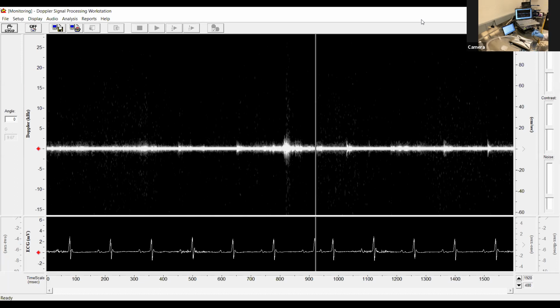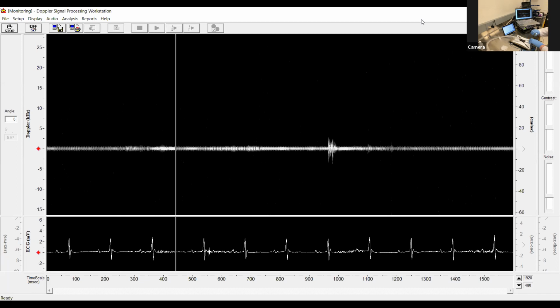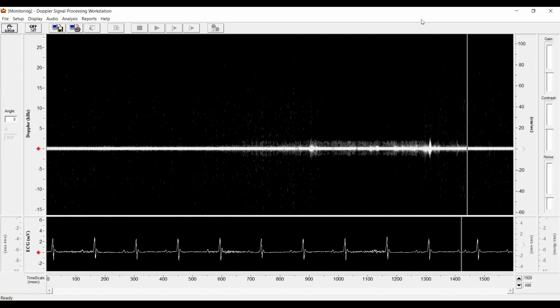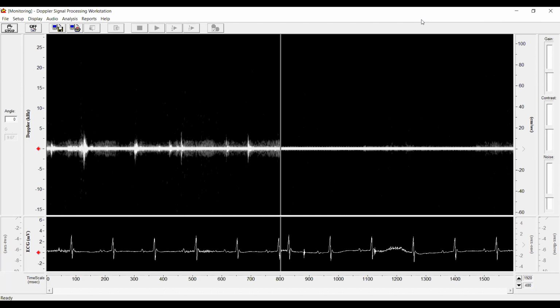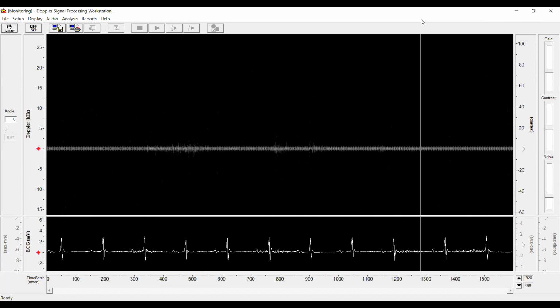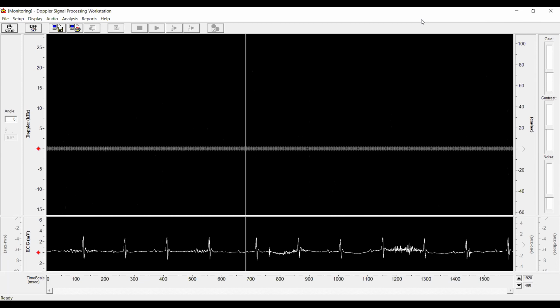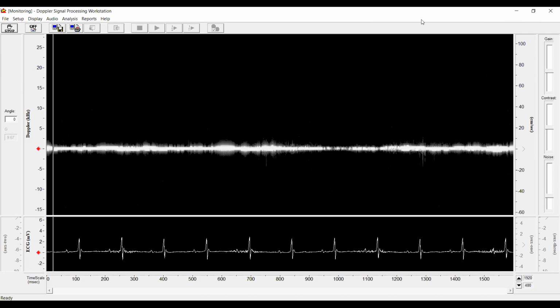Okay, we will have to take the isoflurane off this animal to anesthetize the other one. Okay, and we'll stop the video for this point. I will attempt one last time to get the mitral on this guy before he wakes up. You've got the ISO there, yeah? Okay.